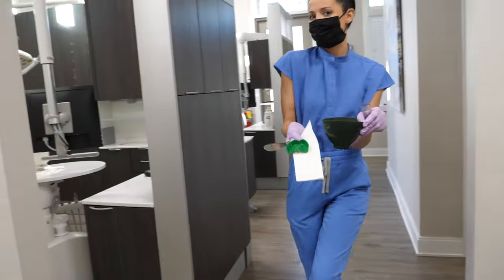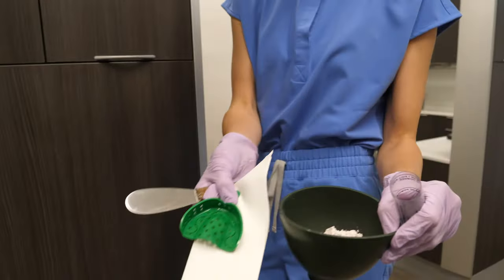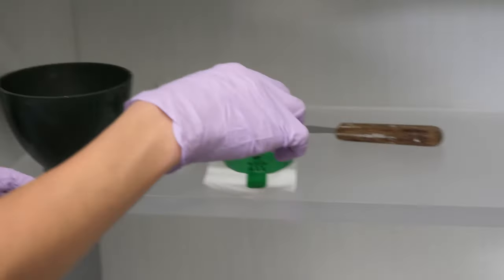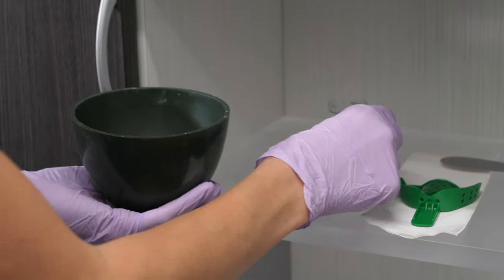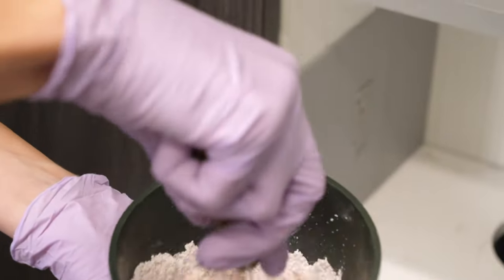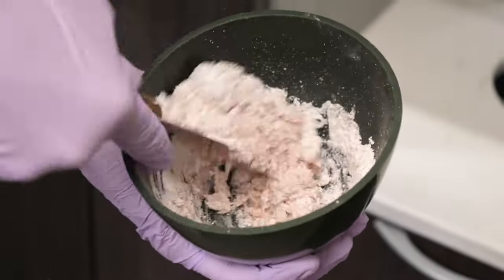This tray fits, so now they will bring the impression stuff to you — all the supplies needed to make a mold of your teeth, including the goop, the sticky impression material. They will generally mix the impression material right next to you since it sets pretty quickly.